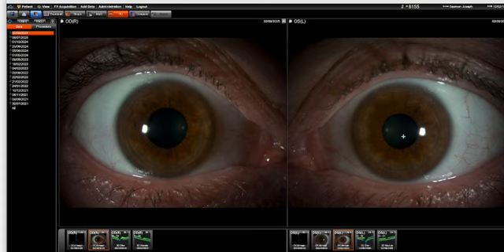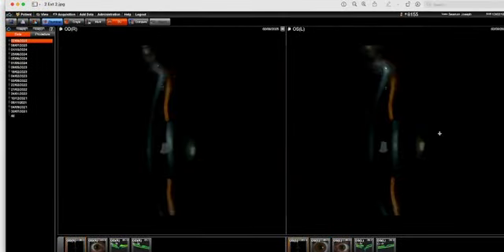First of all, I've got some pictures of the outside of my eye, right and left, allowing us to monitor any changes to the structures of the surface of my eye. Here's a zoomed in picture showing my lens. This is where you'd see a cataract. For me, I have a few little pigment deposits on the outside of my lens, on my left eye, and this shows that in more detail, seeing the pigment dots round here. Again, imaging it like this allows us to monitor for future reference.